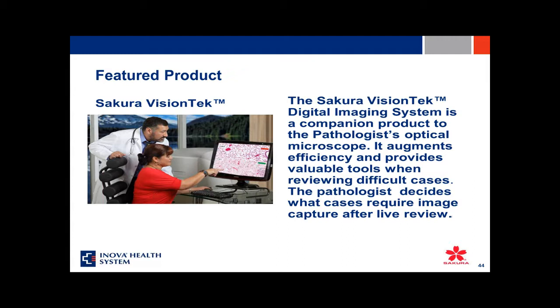So the expectation is during this washout period, it's there so as to eliminate any bias associated between the reads.